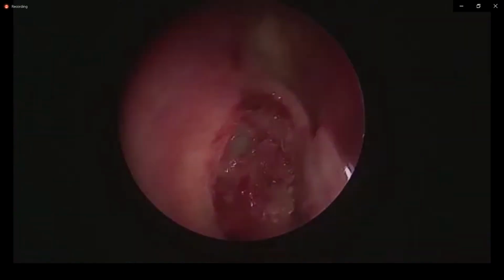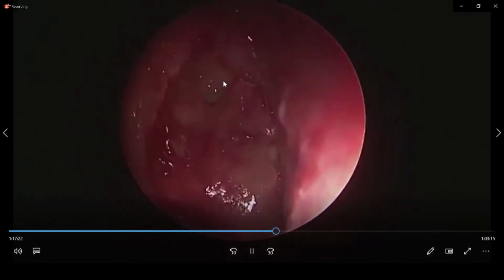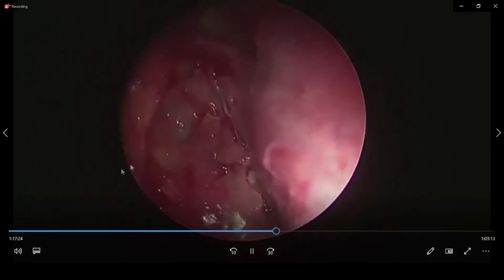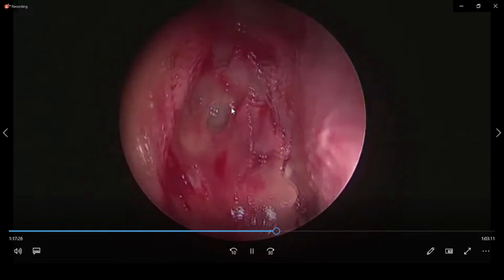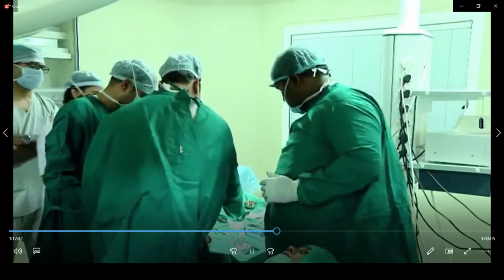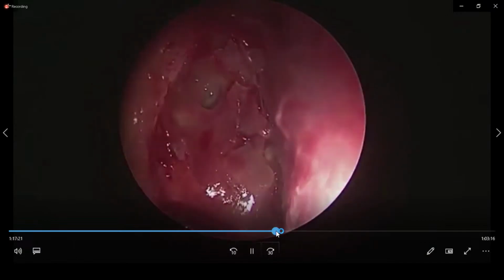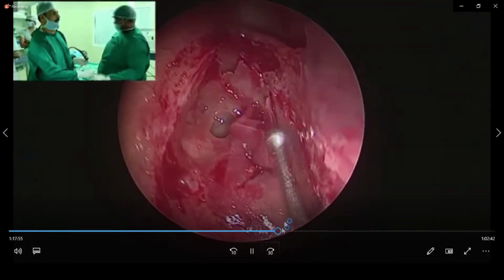As long as the bulla is intact, it covers the anterior ethmoidal artery at the level of the skull base. As it goes to the skull base, the bulla gets attached to the skull base. It covers the anterior ethmoidal artery from anteriorly and protects the artery from getting damaged by the surgeon. So in those situations, the intact bulla technique is the key.